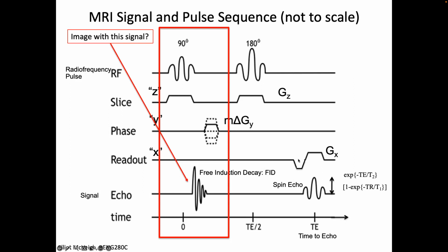And back then you didn't sign consent or anything like that. We just got in the scanner and tried it. Because the phase and readout were in the axial plane, I oriented my body and moved around in the scanner such that the long axis of my heart pointed down the z-axis. So I had the apex of the heart pointing out of one side of the scanner and the base pointing out the other side, but I had to rotate and put my back and my butt up against the side of the scanner, right?